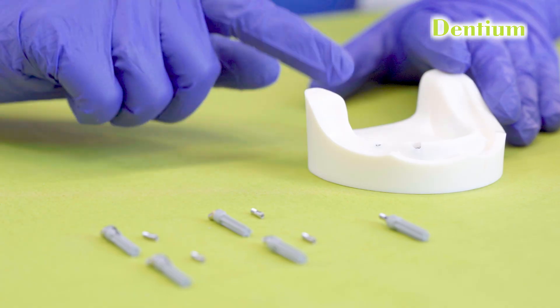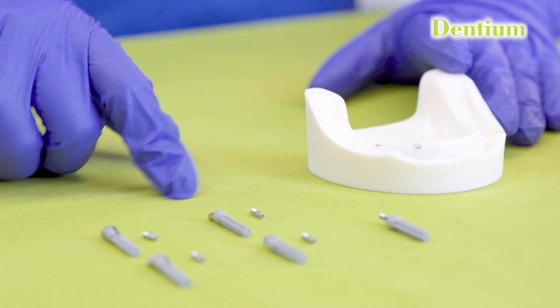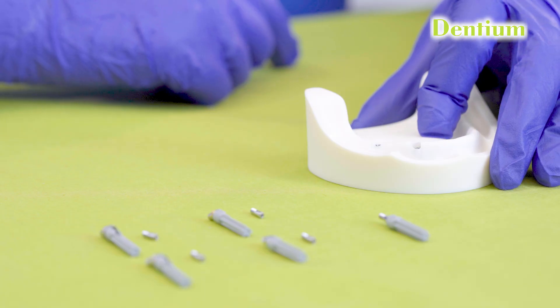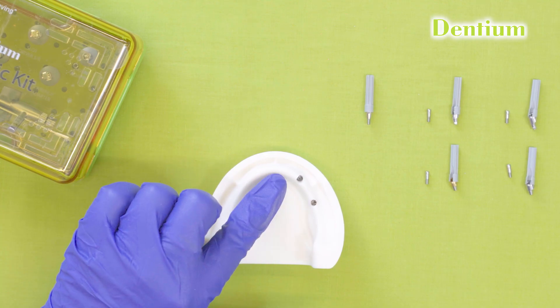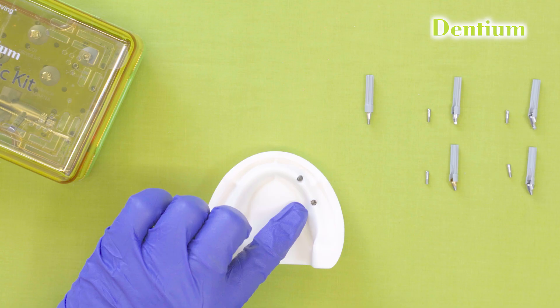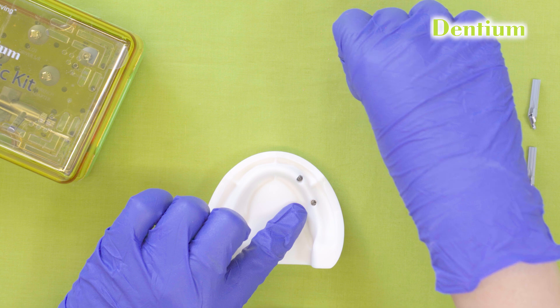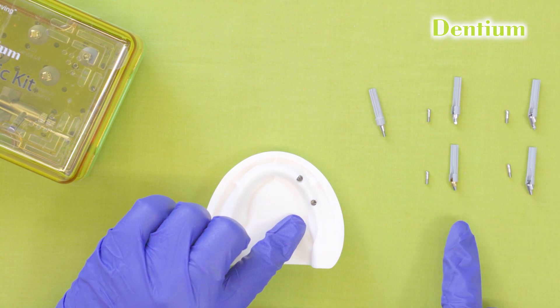I will be demonstrating the placement of these multi-unit abutments in this dummy model. I have already placed two dummy implants in this model — one straight and one angulated. In the straight implant, I will be putting this straight multi-unit abutment, and in the angulated one, I will be putting a 30 degree angulated multi-unit abutment. Before placing the abutments, we need to ensure that the implants are well integrated in the bone and are free from any obstruction. If healing abutments are placed, we need to remove them using the hex driver and start placing the multi-unit abutment.